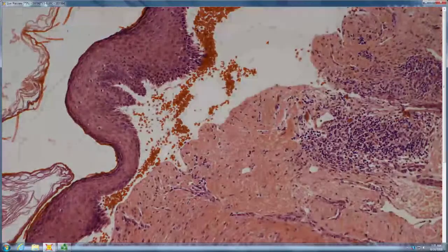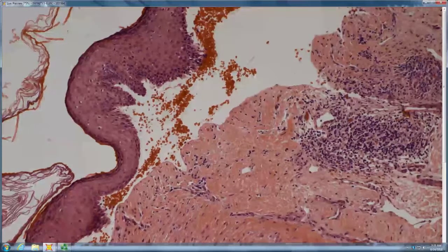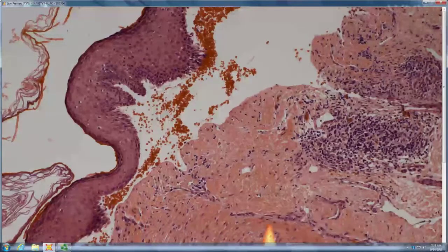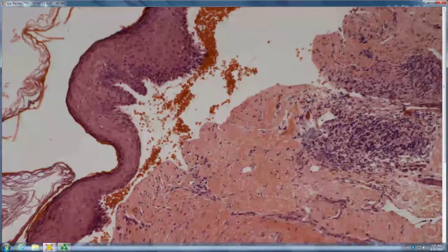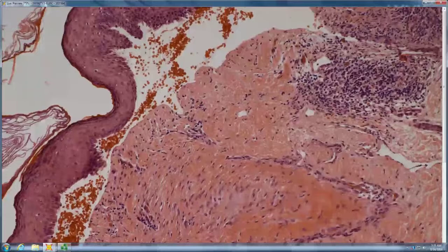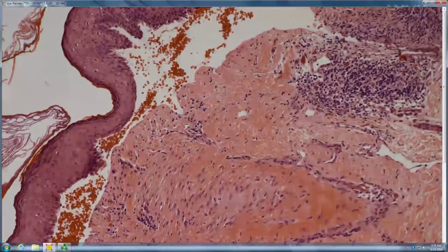It's like a subepidermal split. Subepidermal split, and what's here? This here looks like a lot of fibrosis, kind of east-west, a scar. Yeah, exactly. So you have fibroblasts east-west and vessels vertical. Like EB or EBA. So pemphigoid is probably less likely to scar than some of the other immunobullous diseases, and here you're really seeing dermal scar with it.